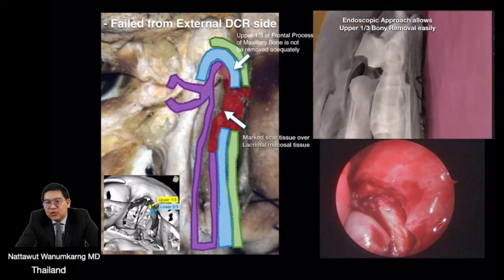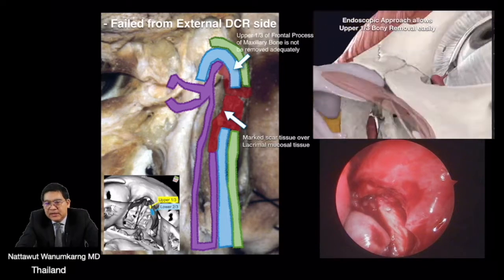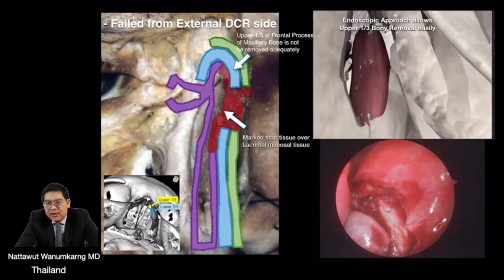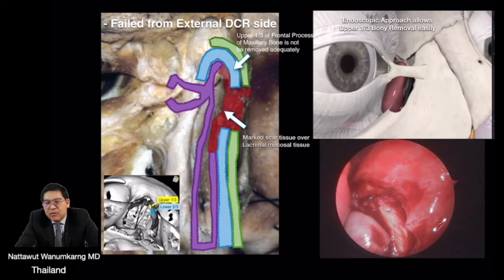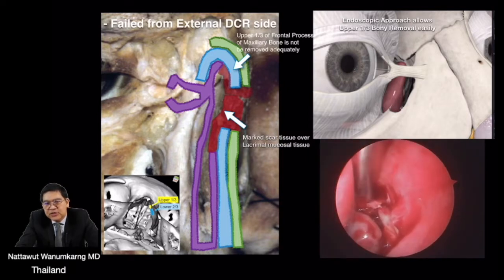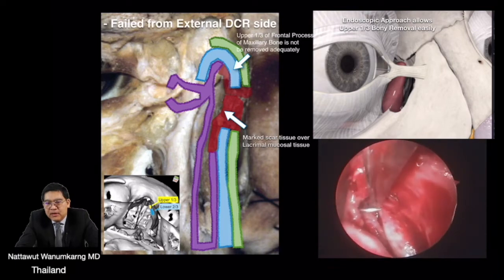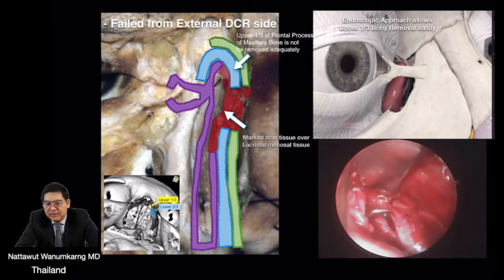The endoscopic approach allows the surgeon to remove the bone over the upper one-third easily and adequately, especially the bone underneath the medial canthal ligament. With the simple technique that we use, a simple chisel and mallet, we remove the bone adequately and conservatively.